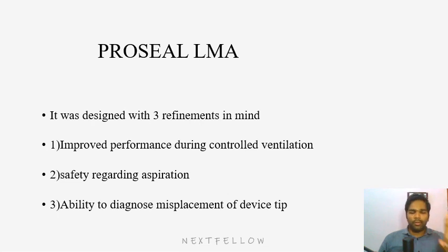Now whatever I told you, we are going to see repeated in the slide. It is designed with three refinements in mind. One is to improve the performance during controlled ventilation. Safety regarding aspiration. Ability to diagnose the misplacement of the tip of the device. So if the tip of the device is not placed properly, you cannot pass the Ryle's tube inside. That is how you find out.